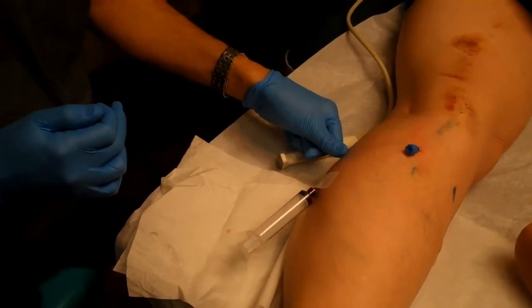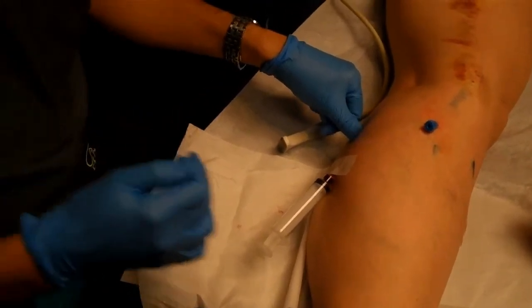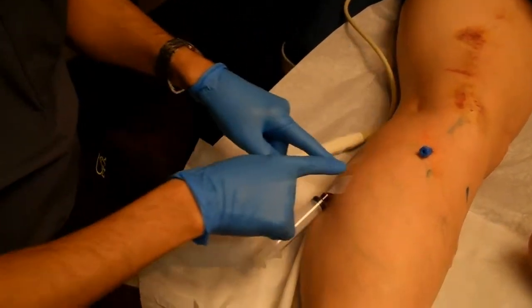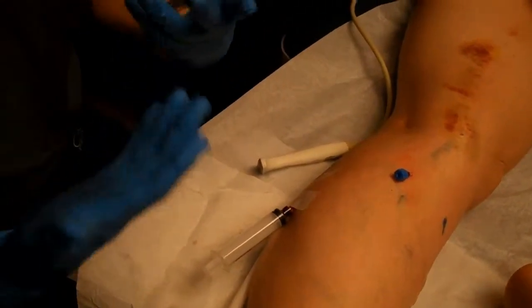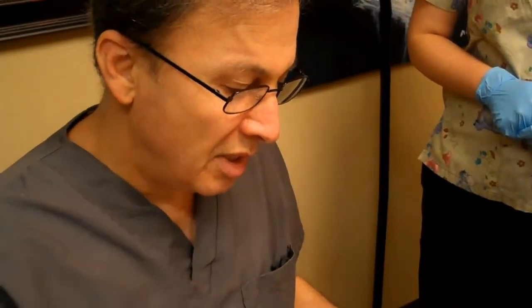We have put a mark here. During the injection, we will manually compress the great saphenous vein here. We will do foam washout of this large varicose zigzag vein, trying to wash it with foam and get the foam out.